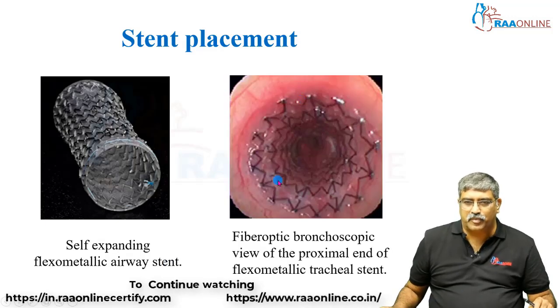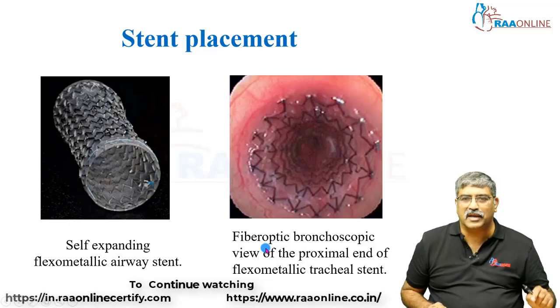This is the fiber optic view of the proximal end of the flexometallic tracheal stent, which is put for tracheal stenosis.